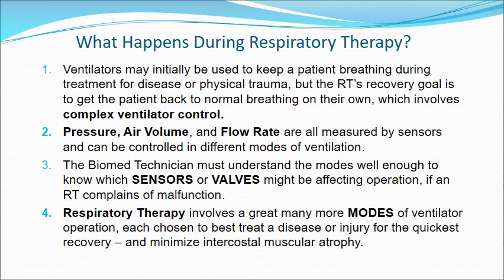Respiratory therapy involves a great many more modes of ventilator operation, each chosen to best treat a disease or injury for the quickest recovery and minimize intercostal muscular atrophy, which happens when the machine takes over breathing.